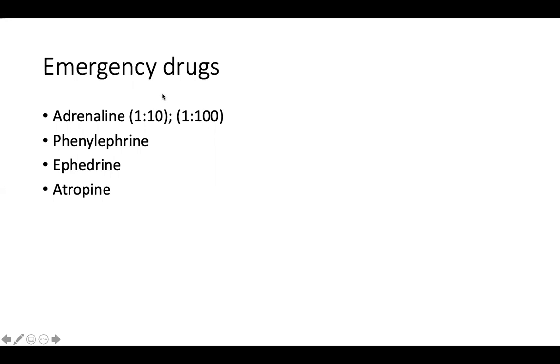So your adrenaline must be ready. In my practice, I do not draw adrenaline, because I found that it's a waste. You normally end up just wasting it. If it's an adult in a cardiac arrest, I always keep my adrenaline vial with me. I know it's not going to take me more than 10 seconds to draw, and in an adult cardiac arrest you're going to give 1 milligram. So it's just 1 ml that I'm going to draw. I've got my syringe, I've got my needle.